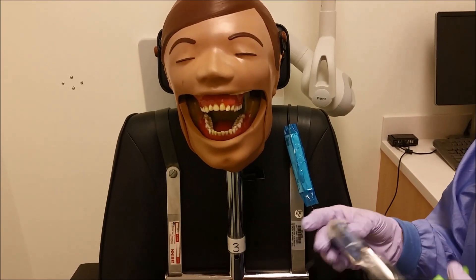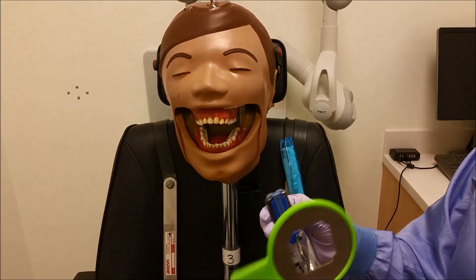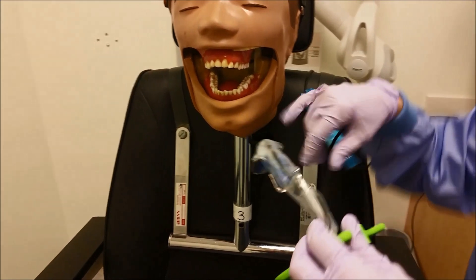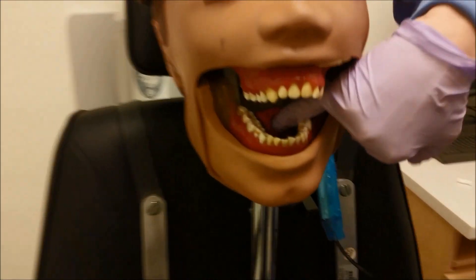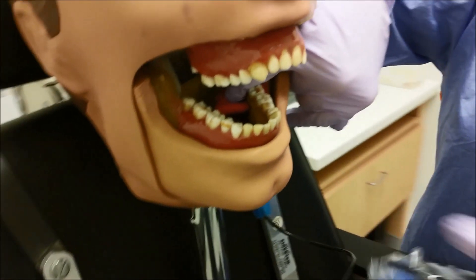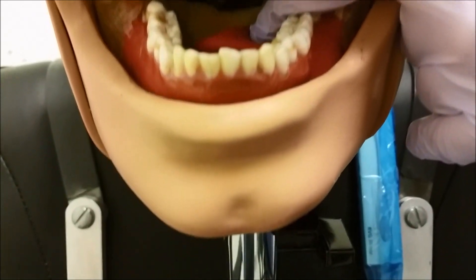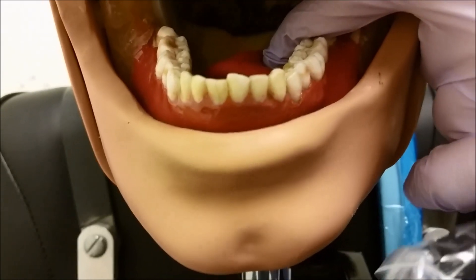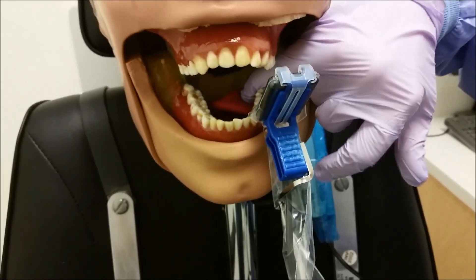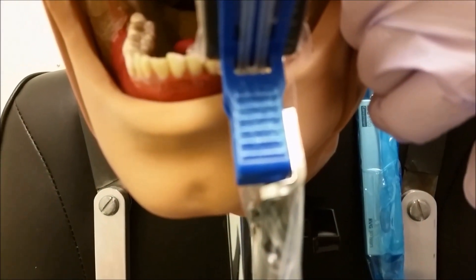Now we're going to be doing the mandibular anterior lateral central. We're going to be using our size one sensor and we're going to center it in our bite block. We're going to push the tongue out of the way, coming in. What you're going to want to do is aim between the contact of your lateral and your central and the middle of your bite block. There's a little bit of a line, and I like to put that line in between that lateral and central.